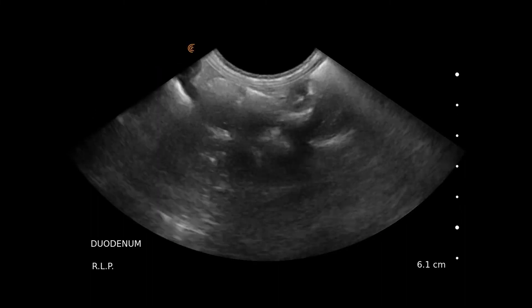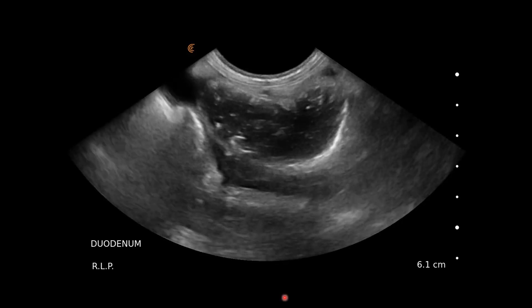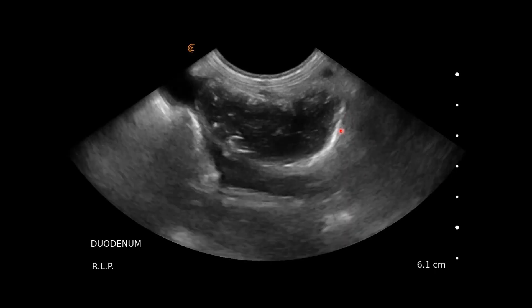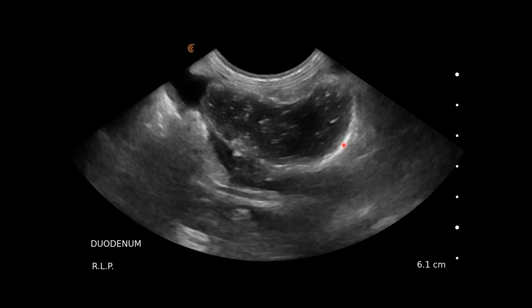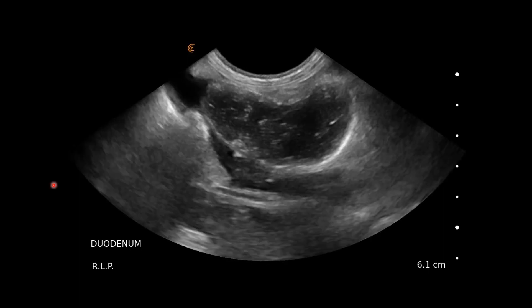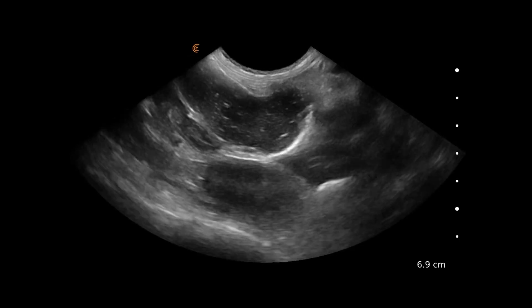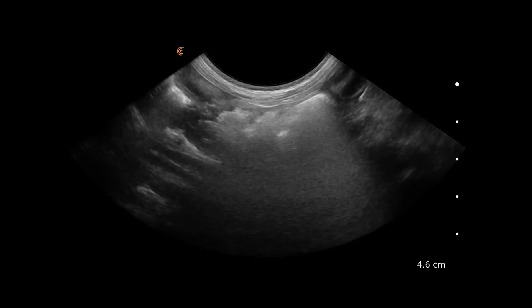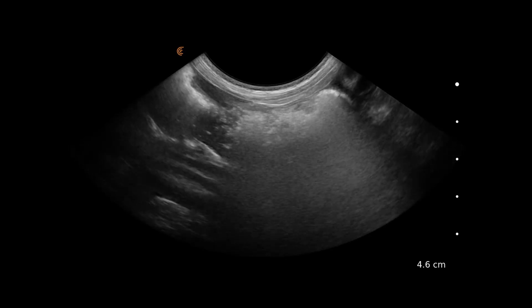Here is the area around the ascending colon, and we can see a dilated loop of intestine in this region.